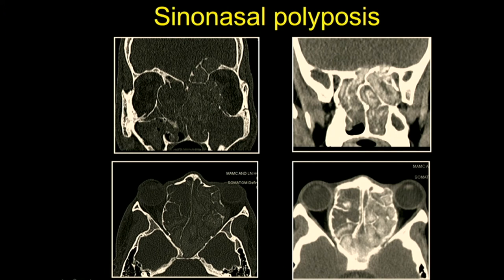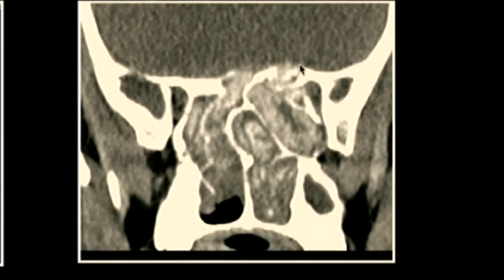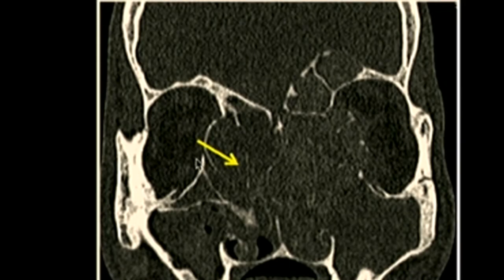Sinonasal polyposis is the Type 4 pattern, which we see very commonly — polyps leading to expansion of the nasal cavity and expansion of the infundibula, with some hyperdensity within, which could also represent allergic fungal sinusitis. Despite extending superiorly, eroding bones, and remodeling surrounding structures, the polypoidal shape is still maintained. Truncation of the bulbous portion of the middle turbinate is a clue to the presence of polyposis in chronic rhinosinusitis.